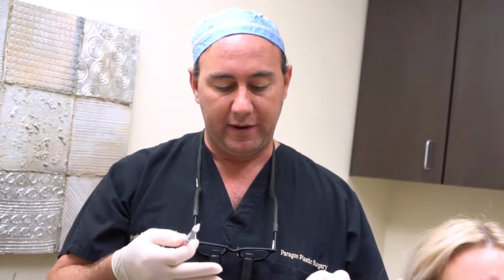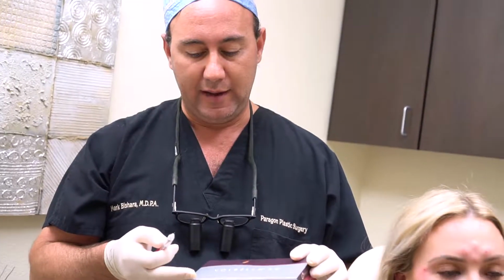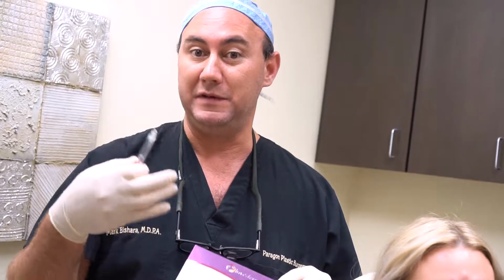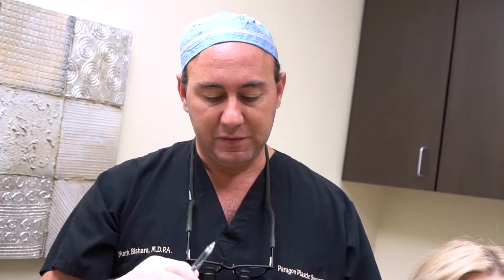A lot of these new products have something called Vycross technology, and that really allows the augmentation of the tissues without having a lot of swelling or having a lot of problems with changing the color of the skin, what's called the Tyndall effect. So you're seeing a little bit of that with Belotero as well. But Volbella's been a great product.